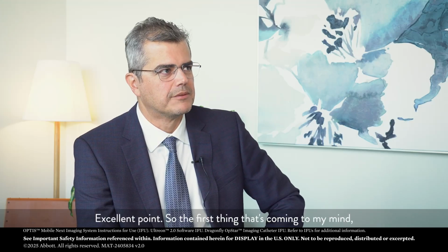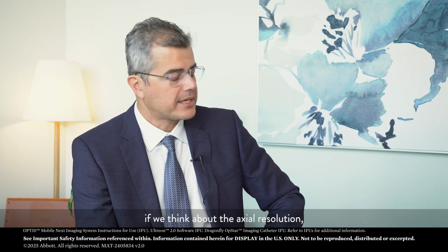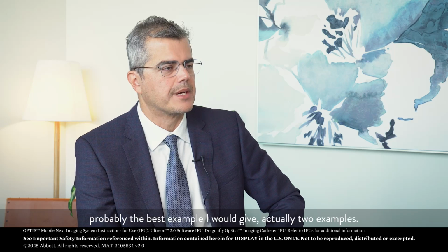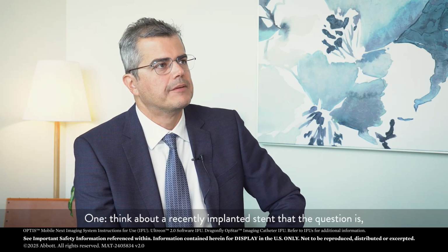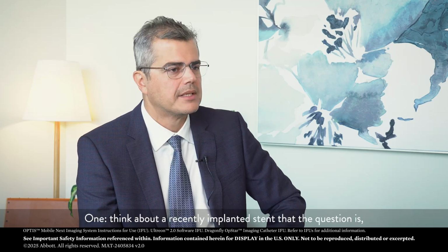Excellent point. If we think about axial resolution, the best example, actually two examples. One, think about a recently implanted stent, where the question is whether this stent is covered by tissue or not.